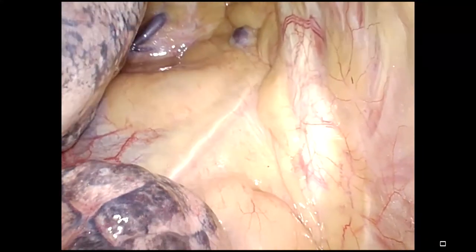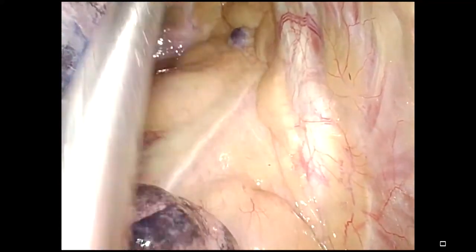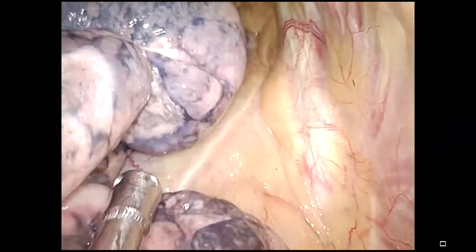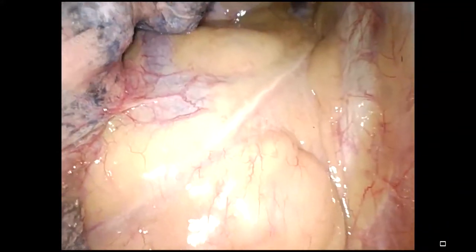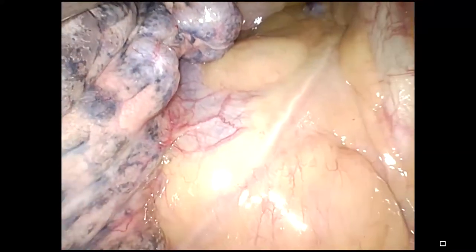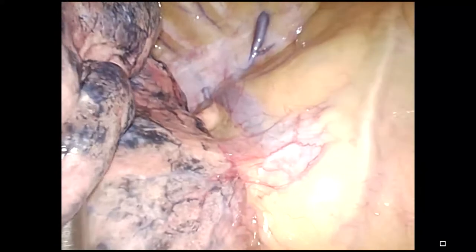We are trying to show you the bronchoscopic view. That would be nice. It's at the entrance of the right upper lobe, so that the primary bronchoplastic technique would be necessary.